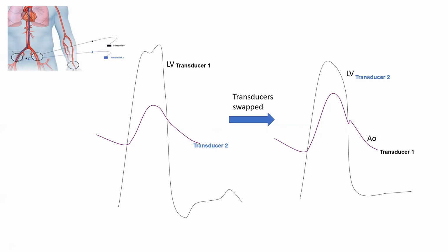So very, very relatively moderate gradient, and you're trying to unveil whether they have low gradient severe AS. So really any few millimeter of mercury error in measurement will translate into big error in measurement of your aortic valve area and your assessment of aortic stenosis. So you really need to obtain perfect measurements. That's why you should not have error in zeroing, and your damping should be somewhat perfect.